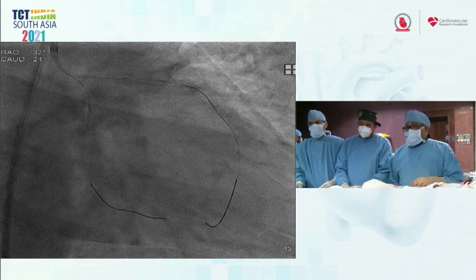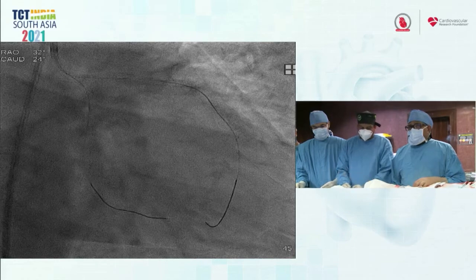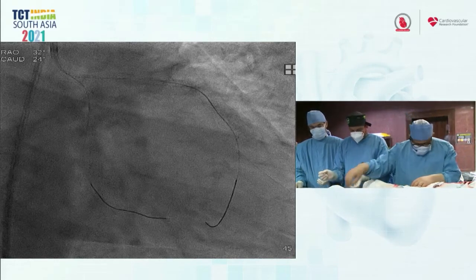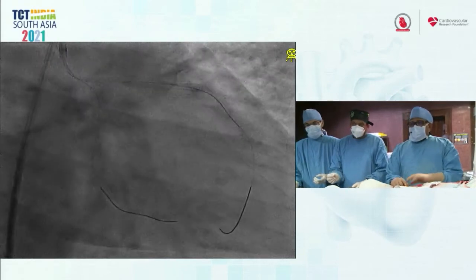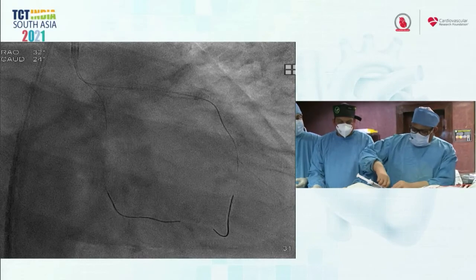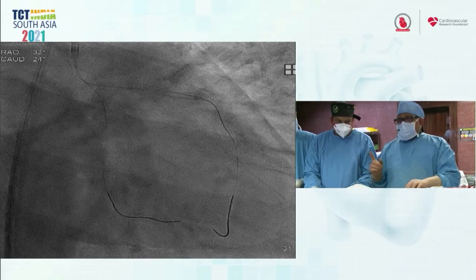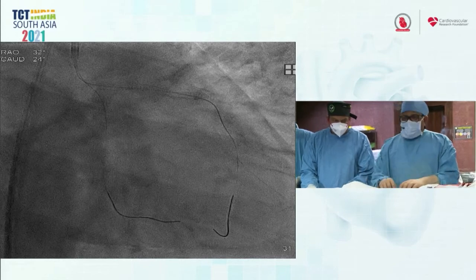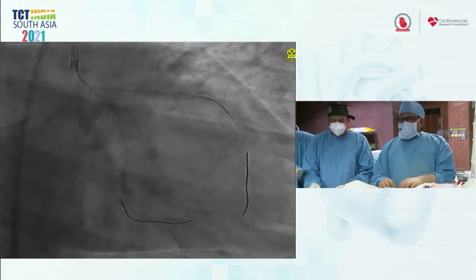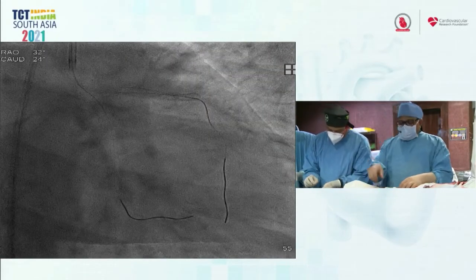So meanwhile, let me go ahead for the IVUS across left main to LAD, and this point can be very well discussed. Mahesh, Srinivas, do we have two minutes to see his final results? Actually, time is over. Just check with him.